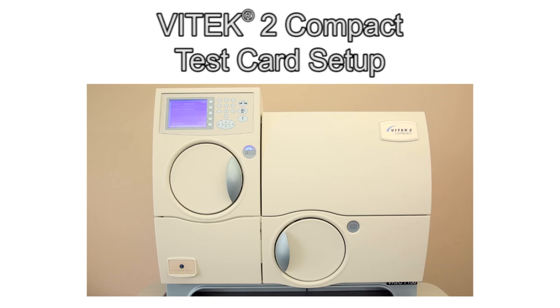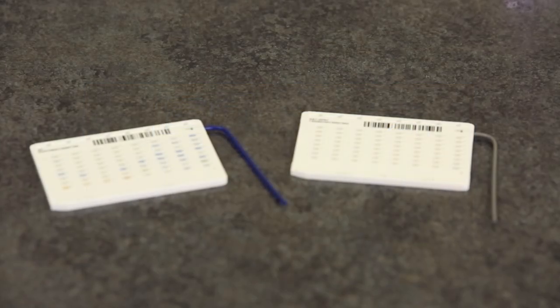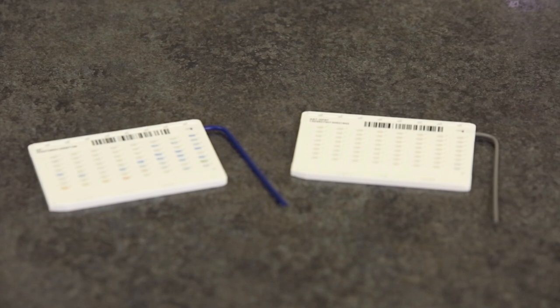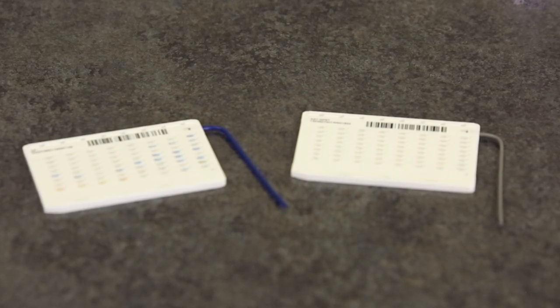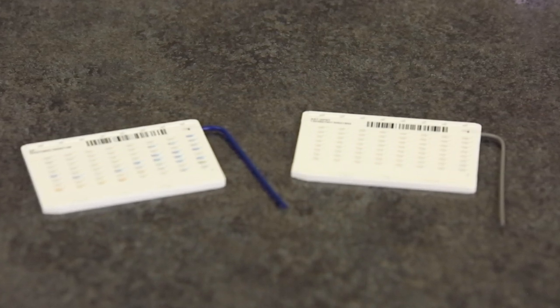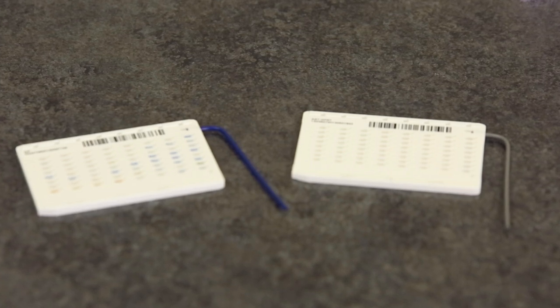The VITEK-2 Compact System simplifies and speeds the identification and susceptibility testing of bacterial and yeast organisms. The purpose of this video is to demonstrate and explain how to set up isolates and test cards for processing on the VITEK-2 Compact instrument.